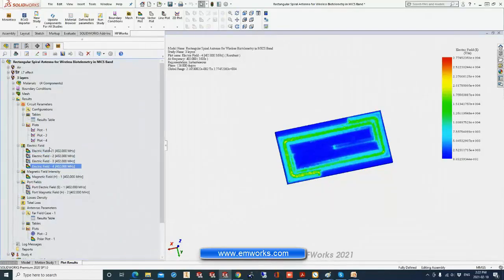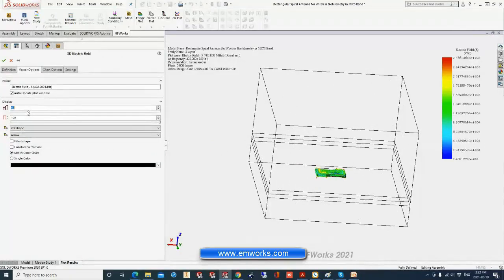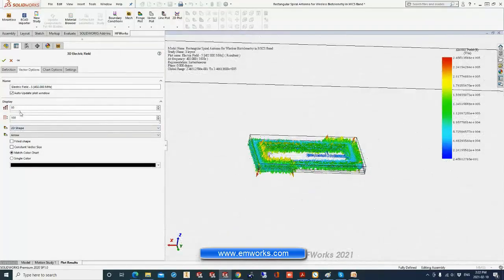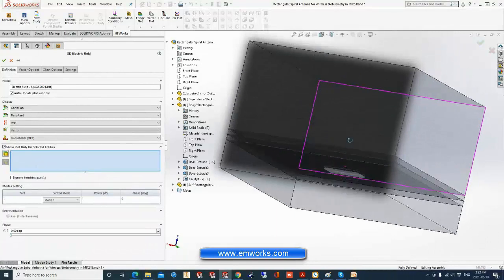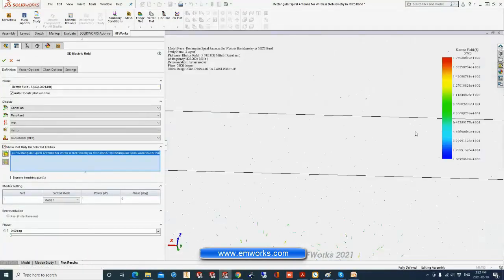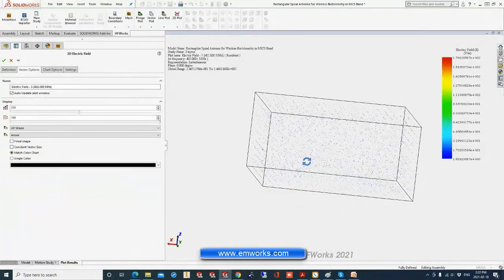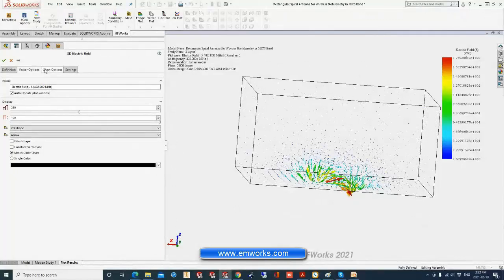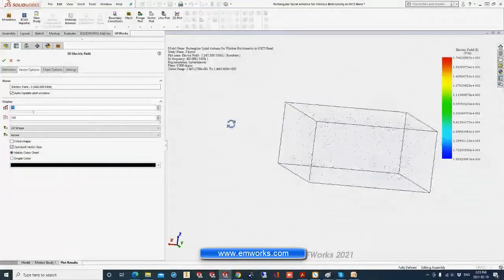We can choose another field format. For example, we can make a vector format, and we can adjust the length and the density of the vectors. We can also see what happened on a selected part, for example, the air part. So this is the field in the air. Actually, I make a constant vector length to see the small values. This is the vector in the air region.